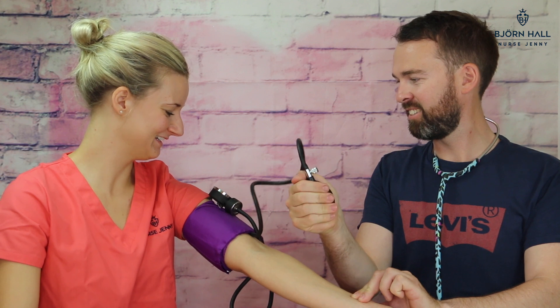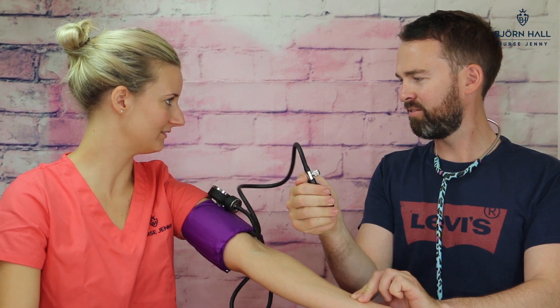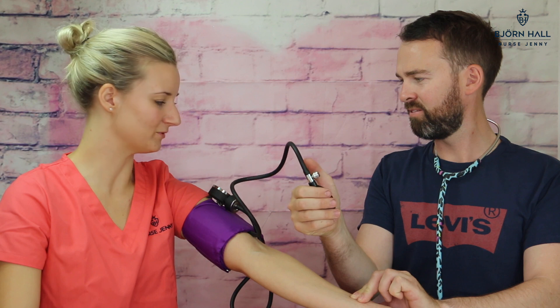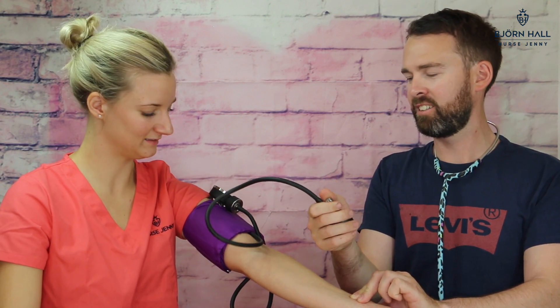It was open. Still feel my pulse? Yep. Oh, it's a bit high. And then release. And the first time you feel the pulse again — it was about a hundred and ten. A hundred and ten. Okay, release it.